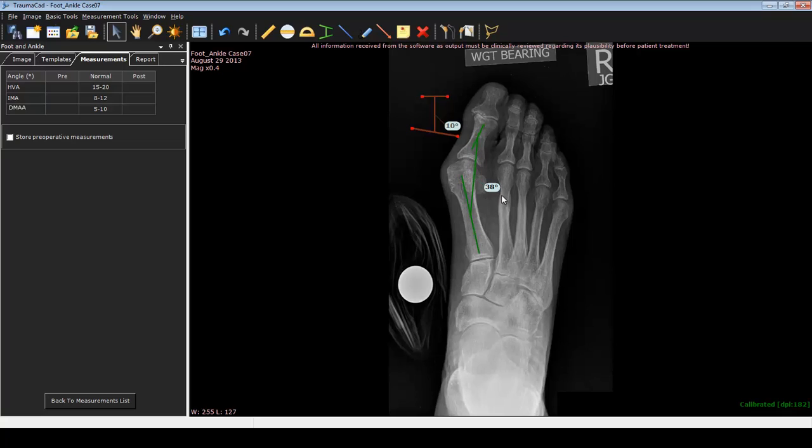That is a very nice instrument to use. It's a nice way to monitor correction without having all those lines that extend out of the bone. Because if you use the other method, the system does not respond well. So I always like to keep my lines within the bone that I'm correcting, because then they also correct when I do my deformity correction.